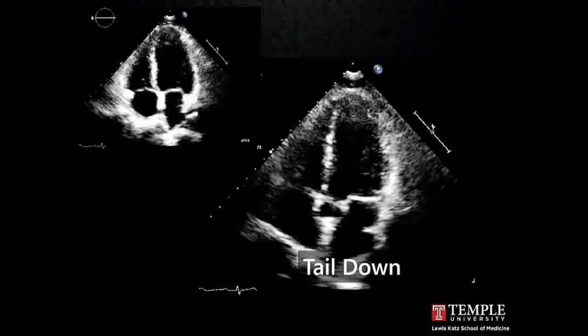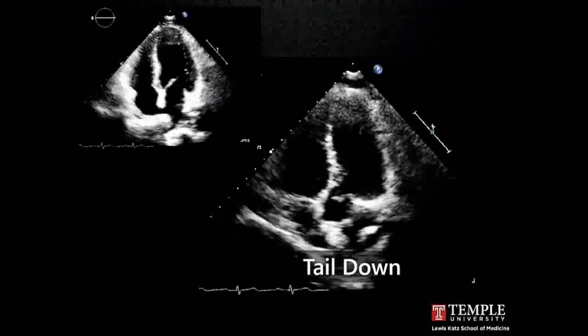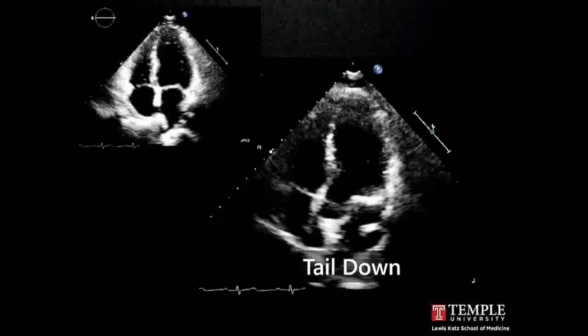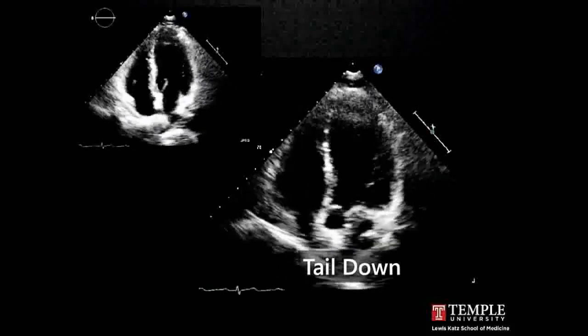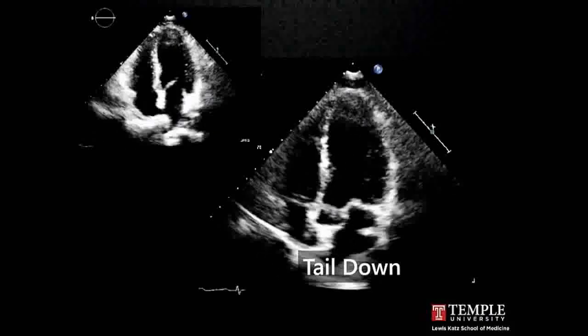These are other hints. How about in the right atrium? We're starting to see structures that aren't the body of the right atrium, but rather the SVC as it enters the right atrium, and maybe some hints of a crista terminalis. So we're obviously angled superiorly. Look outside of what your eye is immediately drawn to, notice that the image is off axis, and this can be corrected by bringing the tail back up and bringing it back onto a four-chamber view.